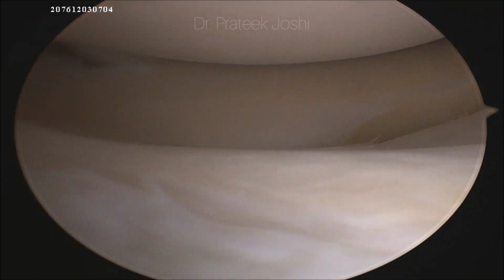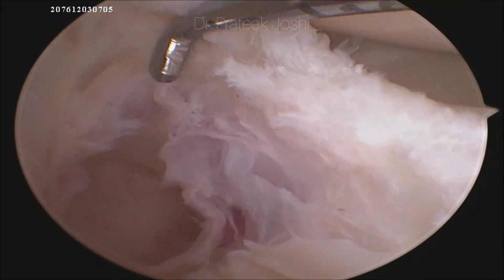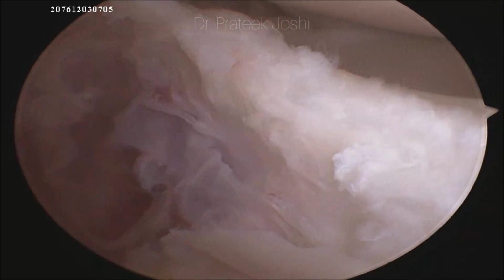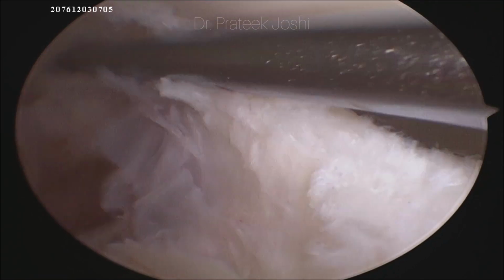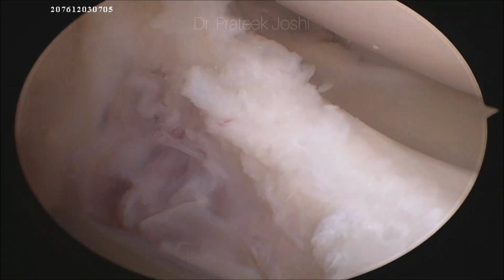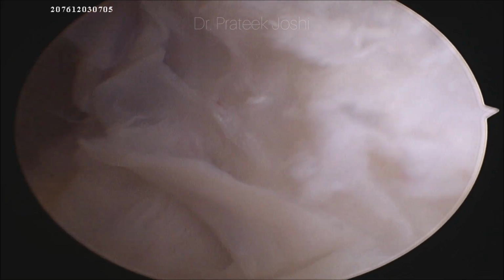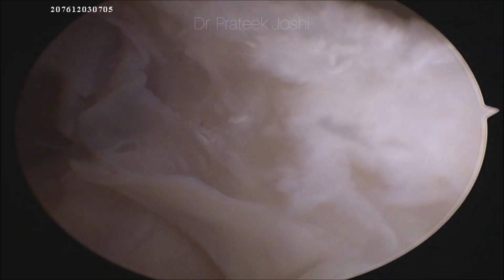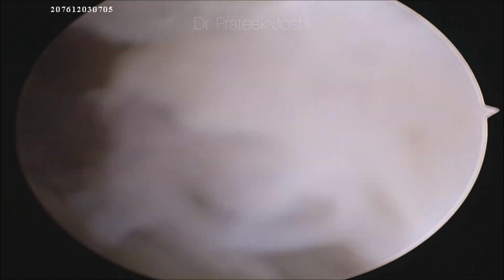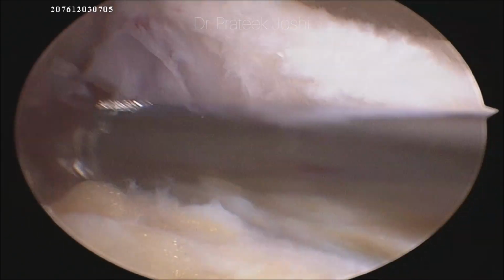So this kind of tear leads to extravasation of the synovial fluid into the subcutaneous plane leading to parameniscal cyst formation. So you can see there is a huge defect between the capsule and the meniscus. Once we do the repair of this tear, this defect should obliterate, and in this region of the meniscus which is vascular, we anticipate good healing potential of the repair that we are going to do.